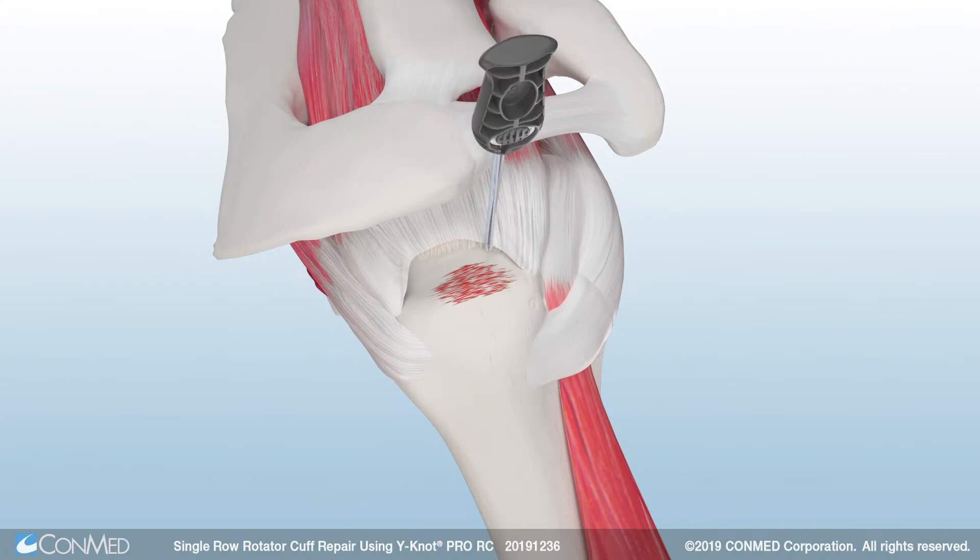To begin, insert the Y-Knot Pro RC with Hi-Fi ribbon at the anterior insertion site of the footprint. Mallet the self-punching anchor into bone until the first laser line has been reached. The anchor features a cleatless delivery system, so simply pull back firmly on the driver handle to unwind the sutures and remove the driver.